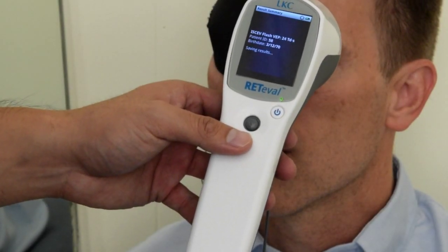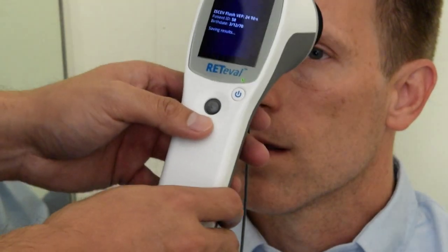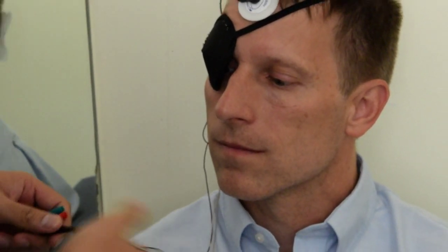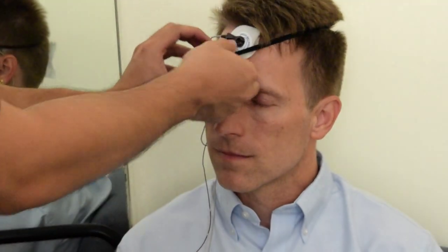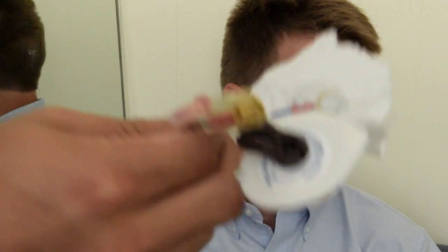Once you have finished the test, the device will save the results. After the results are saved and you've tested both eyes, you can go ahead and remove the electrodes from the patient and you've completed the flash VEP test. Remove the patch as well. The paste is water soluble so you can get a paper towel and scrub the back of the head.